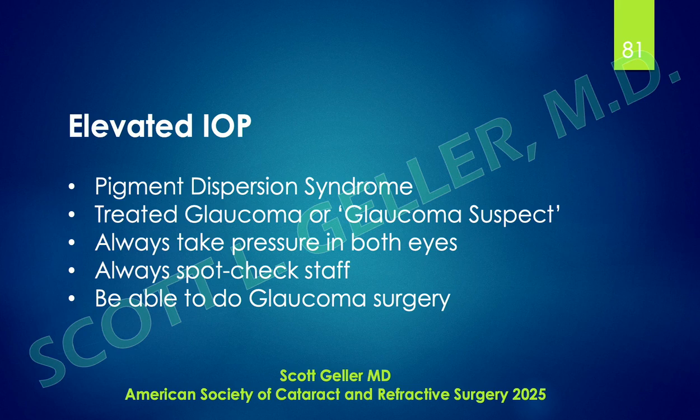What matters is that the operating ophthalmologist, this educated, well-trained guy, put in something like 900 pulses at 6 to 8 or 9 millijoules per pulse. And I understand how you can get wrapped up in it. You're shooting the laser and it looks like it's doing a thing and you just keep going and going and going, which is not the way to do it.